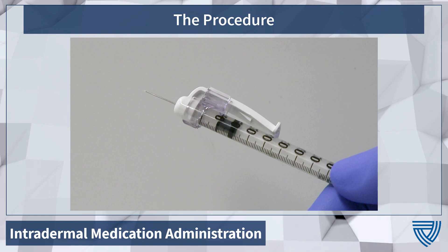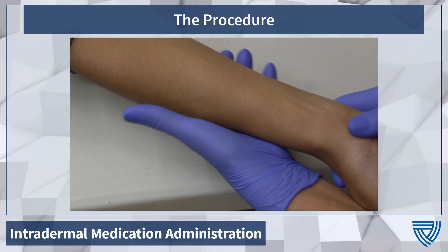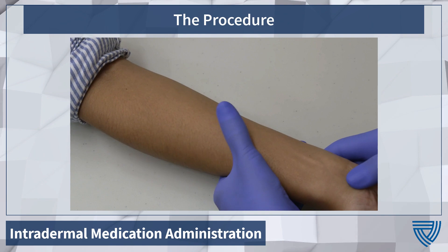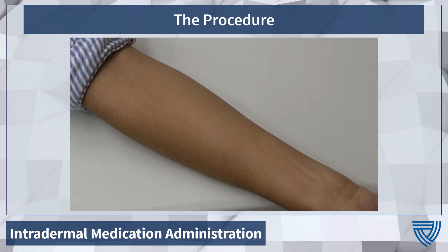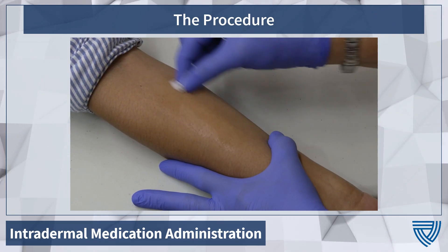We'll be administering a 0.1 milliliter dose. The location of intradermal dose administration is two to three inches below the antecubital fossa. Skin must be held taut, which can be done from below by holding the skin or by holding the skin distal to the injection site. The injection site should be cleaned and allowed to dry prior to medication administration.